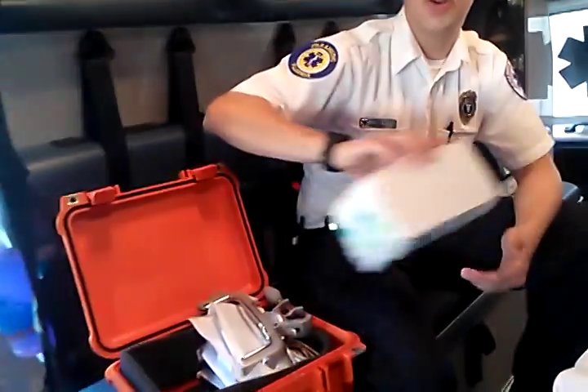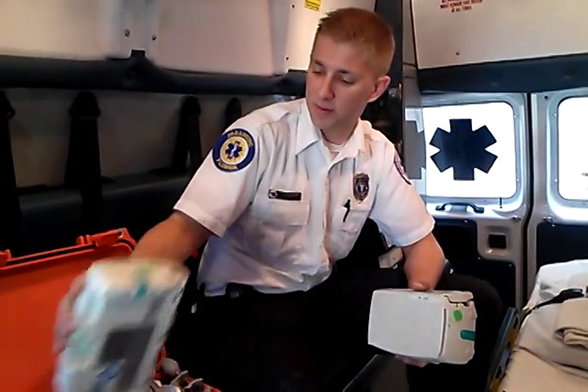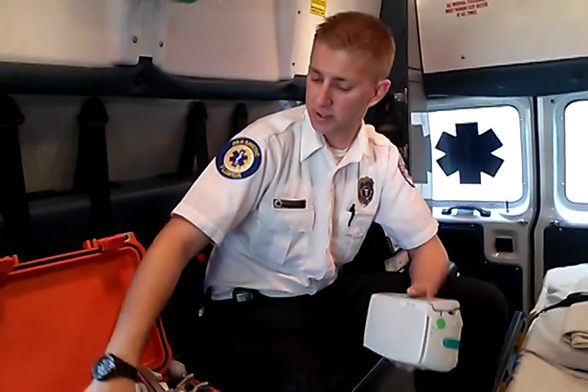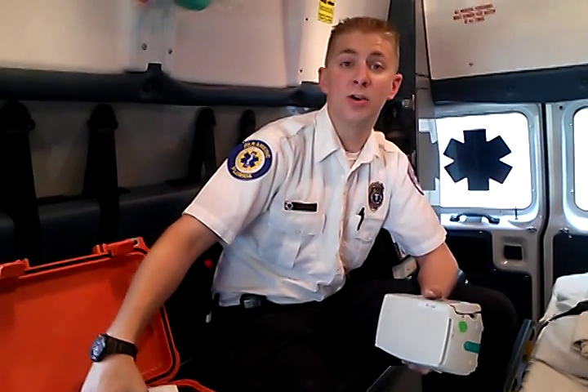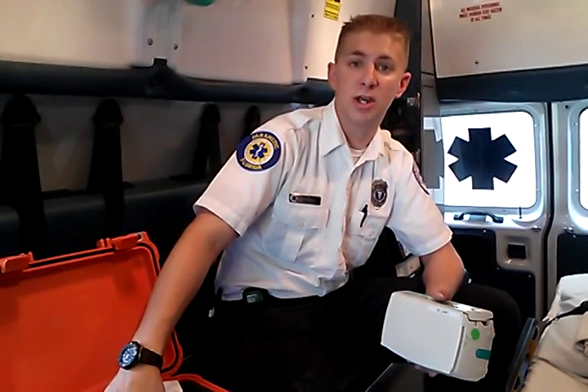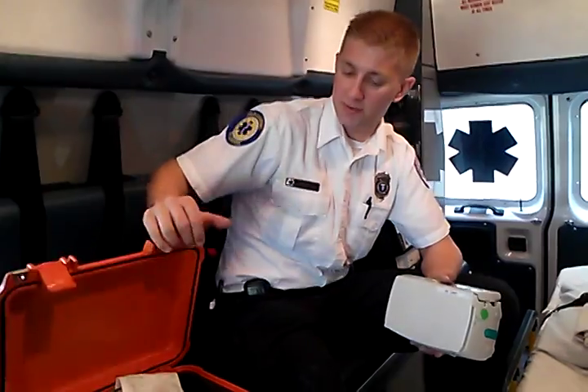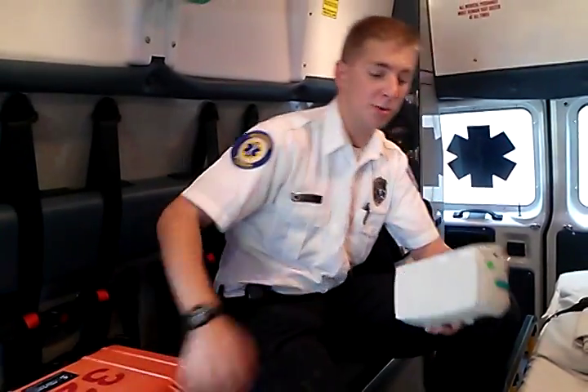I'm going to make two videos. The first video is just how to put the settings in for a basic setup — if you're running an antibiotic drip or something simple like that. I'll make a later video showing how to actually set a drip up where you put a calculation in and set a dosage and concentration — a little more complicated. But today, for this video, we're just going to show you the easy way to do it.